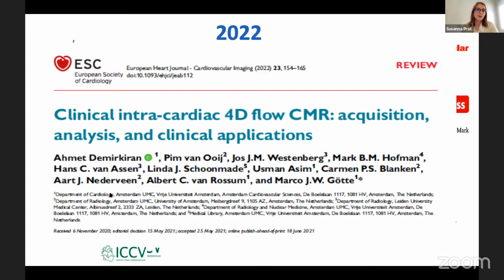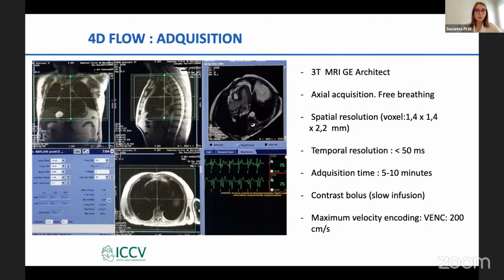All of this shows that there is a lot of interest from people dedicated to cardiac MRI studies, that this can be a good sequence for some of our patients, and that this technology is already here. The idea of this talk is to give a practical overview of how it can help us.